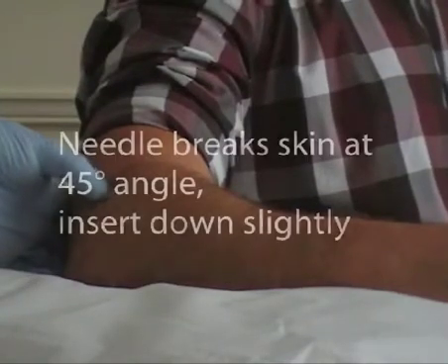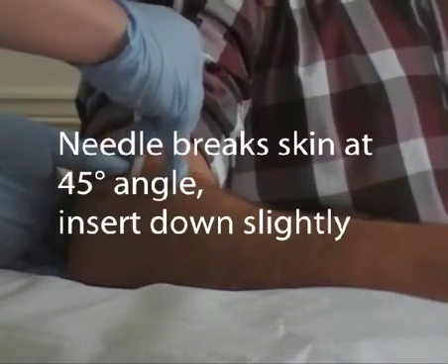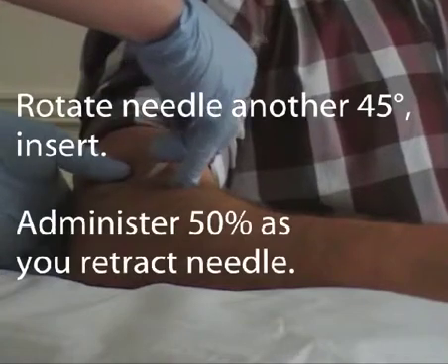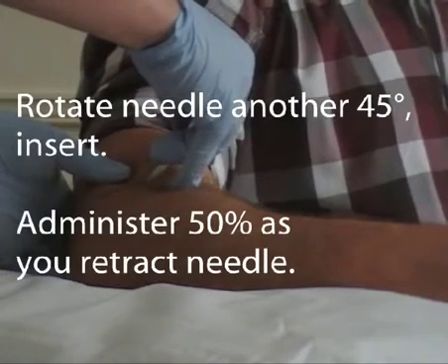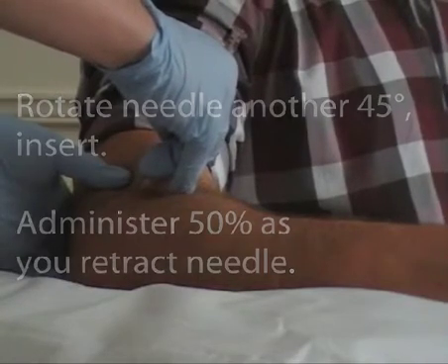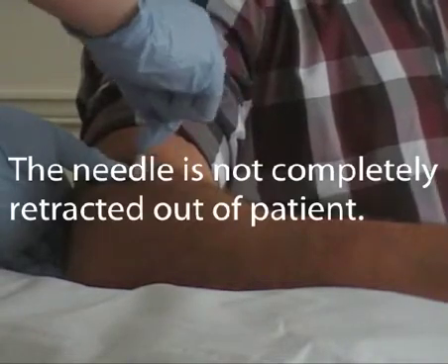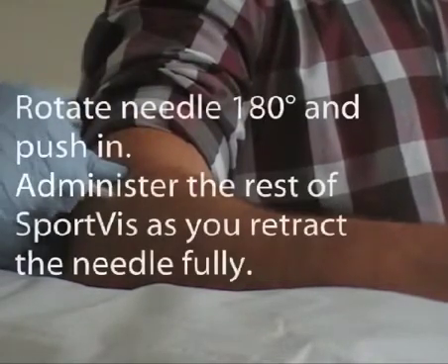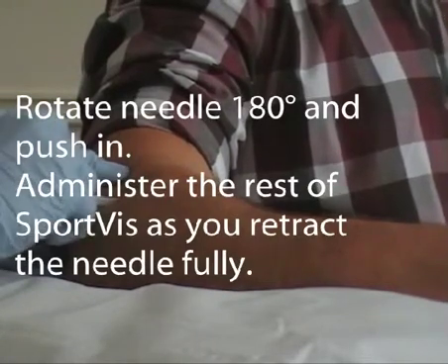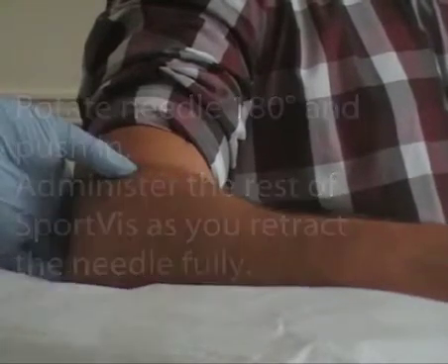When we come to inject, you take the needle in at 45 degrees to that point and insert down onto there, then retract a little as you take it round and insert. As you retract the needle, you administer 50% of the medication. As you take the needle out a little bit further, you then rock round through an arc of about 180 degrees and insert again, retract and administer the other 50%, and then take the needle away.